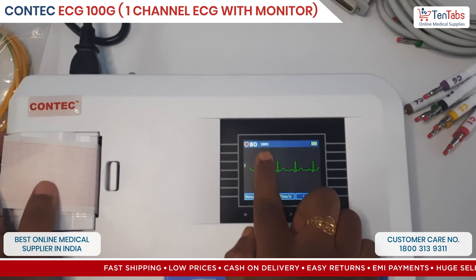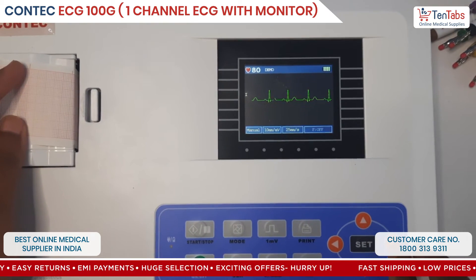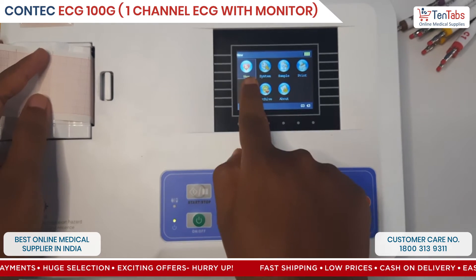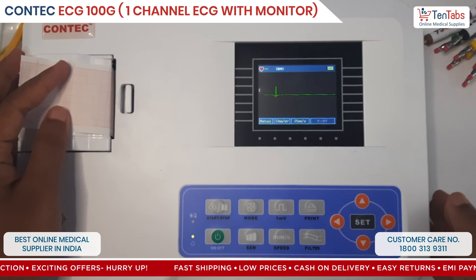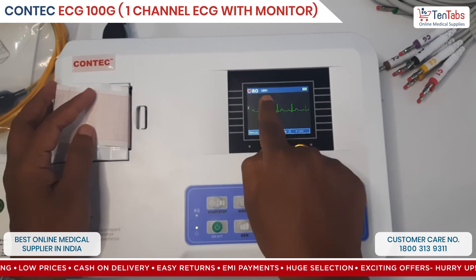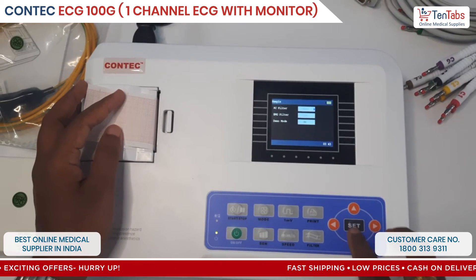Right now on the screen you can see it's in demo mode manual. Anytime you have a new patient, press the start/stop button, select 'New', and connect the patient lead — and there you can see the waveforms. But it is still in demo mode; let me change this. It can be changed in the sample settings.